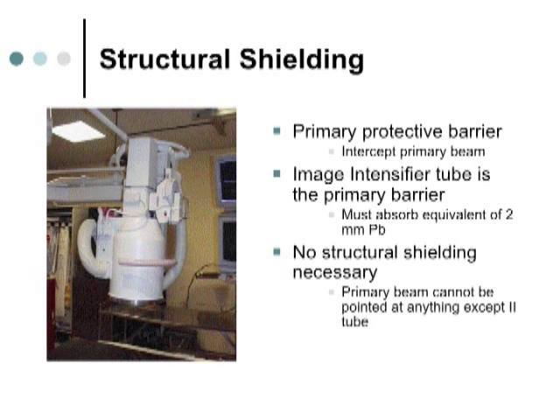So if you have a private office in a medical building or something like that, by positioning that unit far away from those walls, it can prevent shielding. Because with a C-arm or with a stationary unit, the image intensifier itself is going to be your primary barrier. It has to have the beam collimated no larger than the size of the input phosphor. And as you mag it, go to the 4-inch and the 6-inch mode, the beam will be collimated more and magnified at the other end.